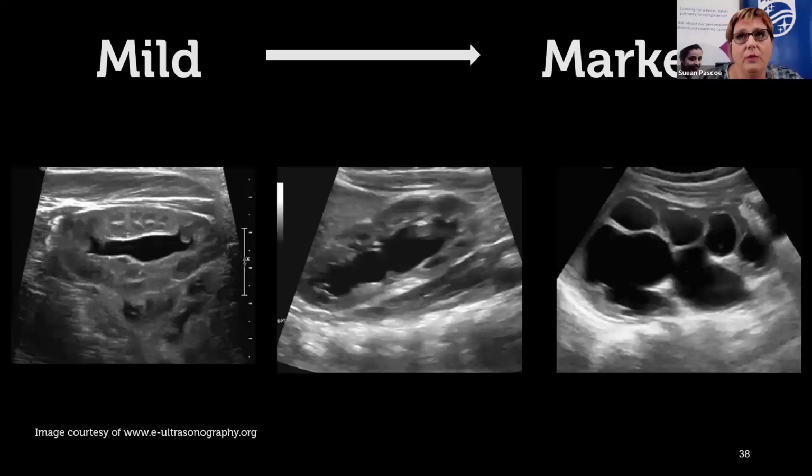I would turn into a short axis view and put the color on, and you'd be able to see what's vessel and what's not. At the pelvis, the renal vessels, the renal artery and vein, are really quite easy to determine on the color Doppler. But I guess it's a pattern recognition thing. You could practice on your pregnant patients in the first trimester. If they're about 10 to 12 weeks, they're going to have mild hydronephrosis of the right kidney pretty much most of the time, just because of where the baby is sitting, it's starting to obstruct the pelvis, obstruct the ureter.